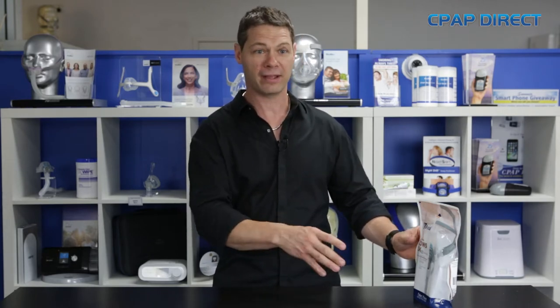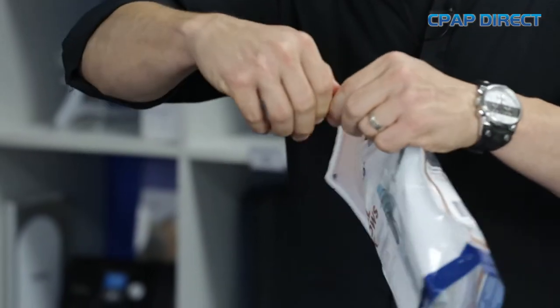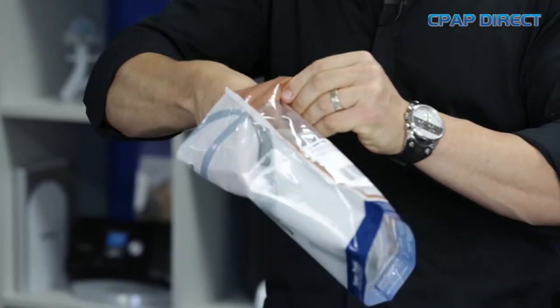I'm that impressed with the new Brevita mask, and I think you will be as well when I show you how this works. So let's open one up and I'll show you what you get in the packet. The packet looks like this — there's a tear at the top — and we open her up.